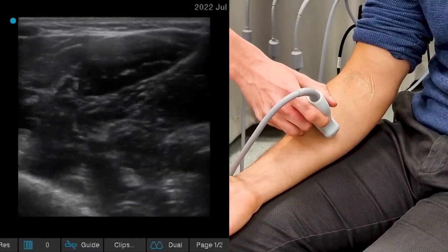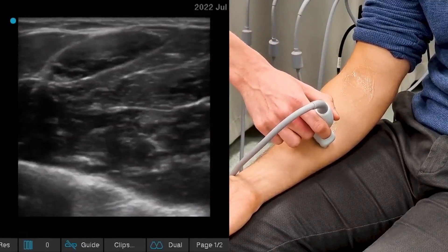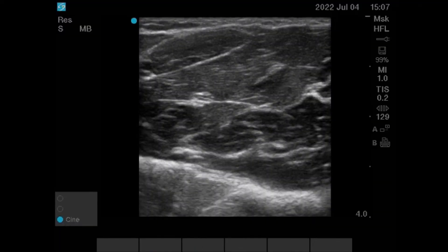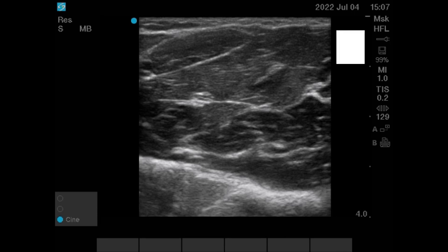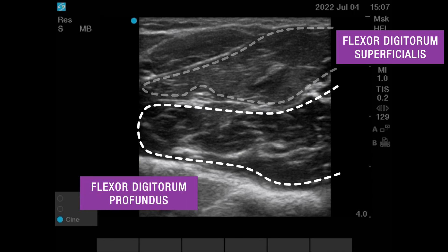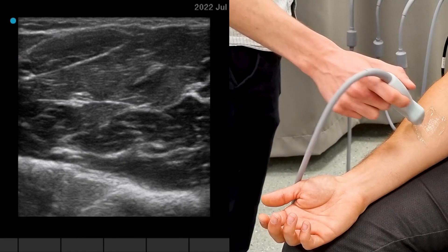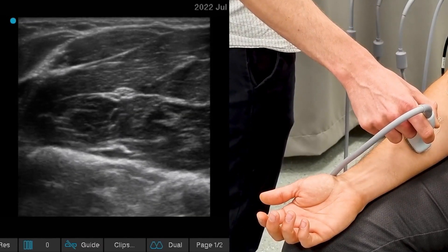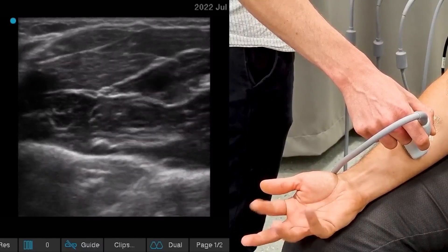If we move further down the arm and place the transducer in the mid forearm, we can see lots of muscles. In the middle of the screen, the bright white is the median nerve. Surrounding the median nerve are various muscles — these are flexor digitorum superficialis and flexor digitorum profundus. We can also see flexor carpi radialis. To demonstrate the movements of the muscles, we will ask our patient to wiggle his fingers, and you can see the movements in his flexor digitorum muscles.